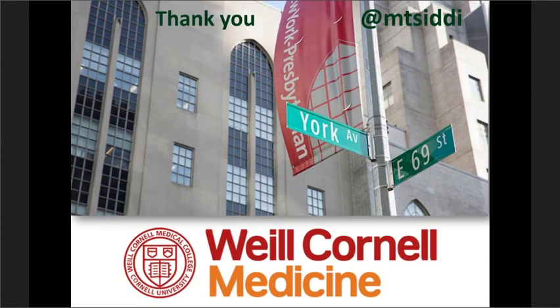Mm-hmm. All right. I said that was the last, but there's a couple of other questions. Sure. Liquid-based preparations, since there's a couple on the same area, if you don't mind me asking. Not at all. The participants are wondering, what is your experience? Say for instance, they are in a lab and they get sent out from a hospital 20 miles down the road, and all you have is these liquid-based preparations. Can we still make a diagnosis on these? Can we still grade these?